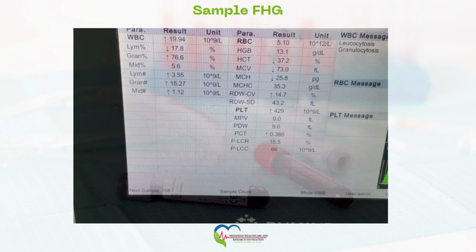We said number one, you look at the range, and the range is high in the white blood cells. So that signals an inflammatory action. Two, you look at the trend. We don't have the trend, but if this full hemogram is a second one, and the other one had been taken and was at 26, then we can say it's getting better. And also, if the first one had been taken and it was at 12 and something was done, then we can say it's worsening the situation. So that is the second thing. You have to look at the trend. We cannot look at the trend here.